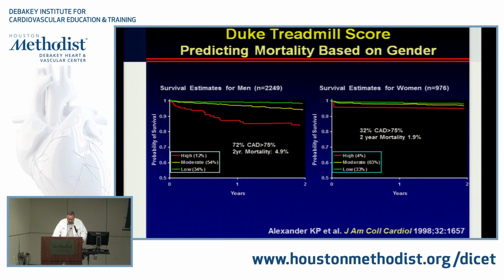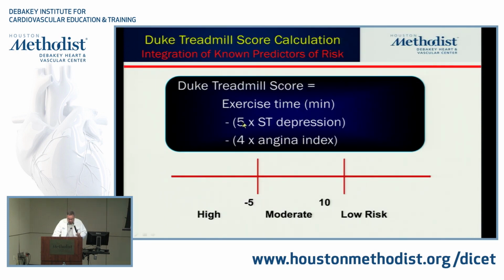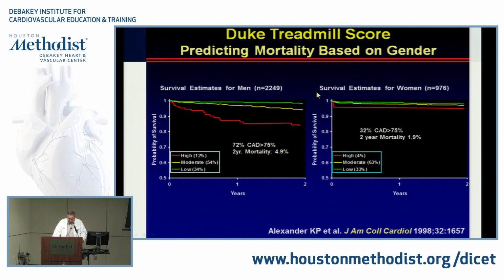Yeah, because basically it's a treadmill test. Obviously, you don't have a pharmacologic test. So basically, it's just exercise times, the usual business. So this can be used in any system. And I did not know this until I started to meet more people and talk with community physicians. And actually, in a lot of little towns around, people still use this because of that. I mean, there's data to support, and that's why it's appropriate. That's why the guidelines still say it is an appropriate test.